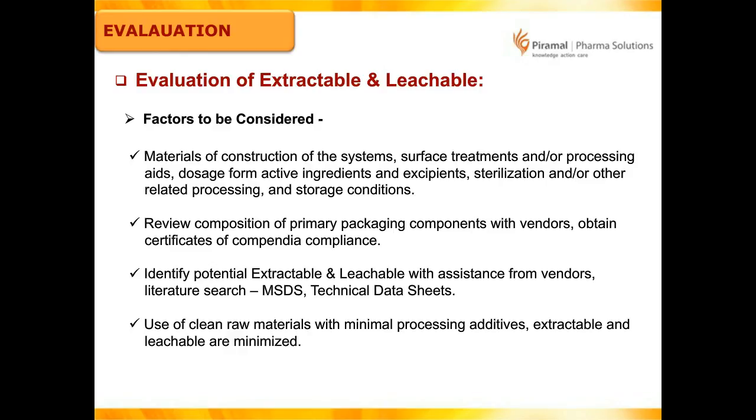So as a finished product, whether you have an aqueous drug product or a non-aqueous drug product, the behavior of your drug product can have different extractables, because the migration from the rubber stopper to your drug product purely depends on the nature of the drug product. So yes, your vendor will give all the details of extractables. Say they have provided 10 extractables in the certificate of analysis. There is a possibility your drug product is not capable of extracting all those components.